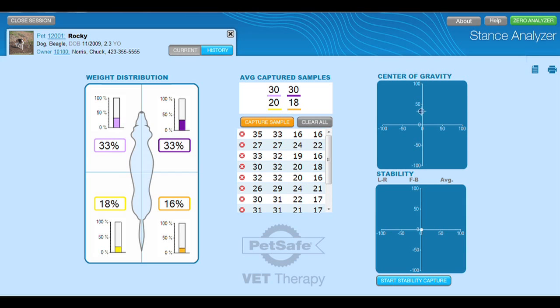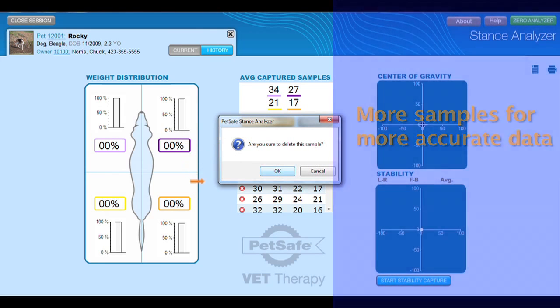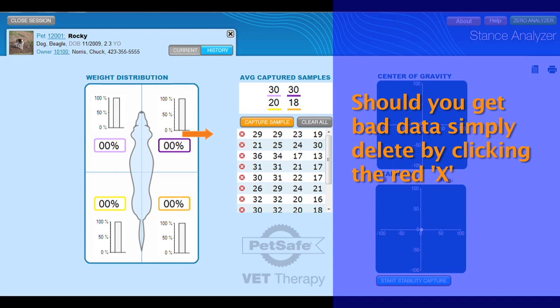Below that are the buttons where you can collect samples and clear out your whole session to start over. You can collect samples by pressing 1 on your handheld remote. Beneath the buttons is a list of all of the samples you have captured. You also have the ability to groom your data — if you capture some data that was misrepresentative of your patient, you can simply remove that sample from your list. And like any study, the more samples you collect, the more valid your results become.